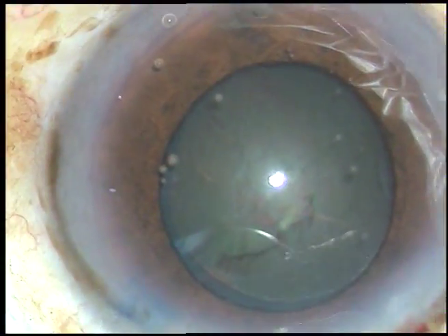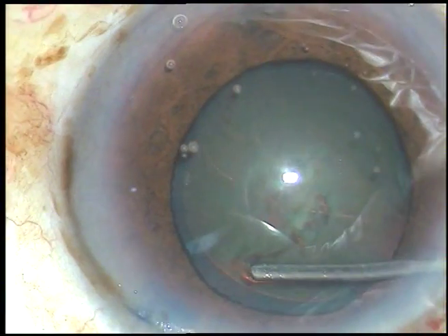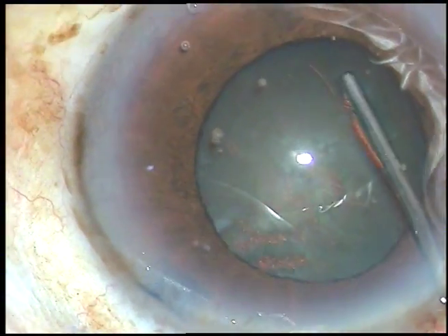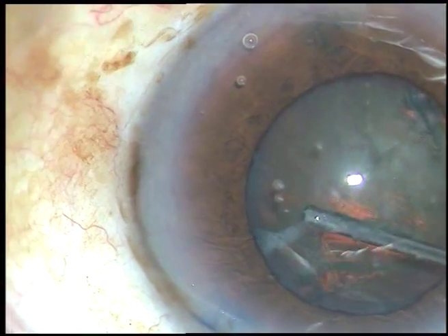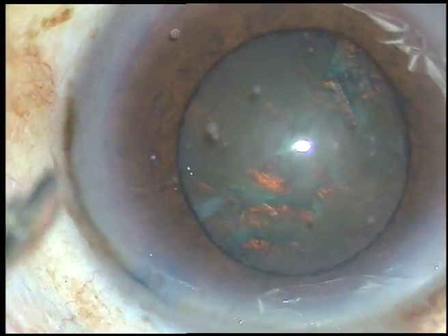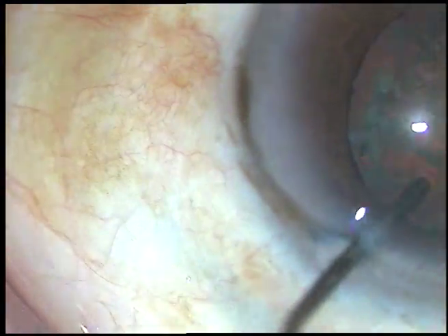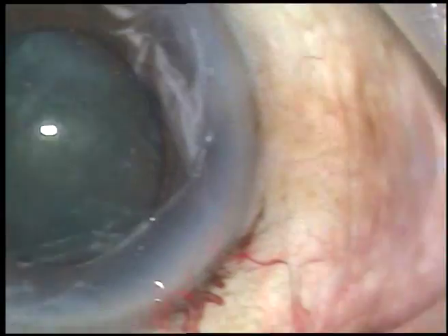Now hydrodissection is to be done, and this has to be done with very much caution. A little bit of fluid is injected and the nucleus is tapped. Hydrodissection is done from the opposite side also, and the nucleus is tapped again. And now you can see that the nucleus is rotating very nicely.